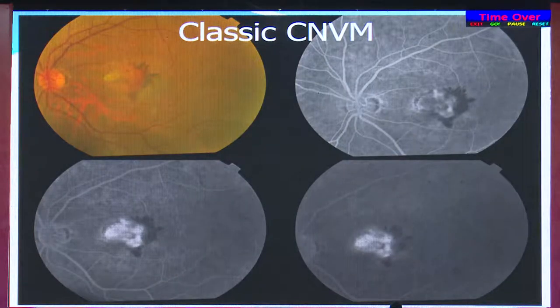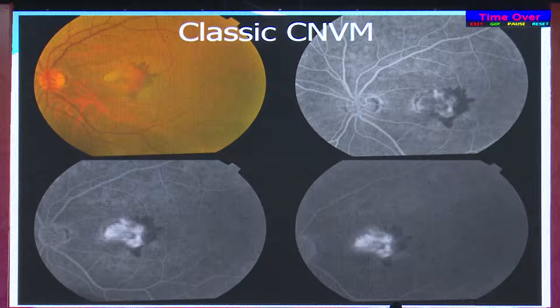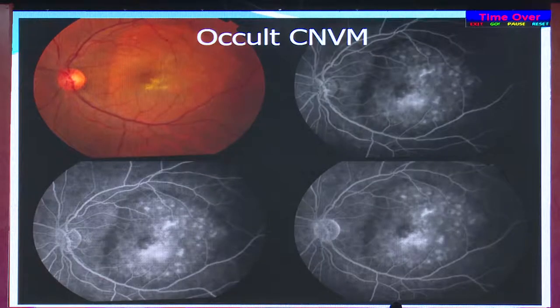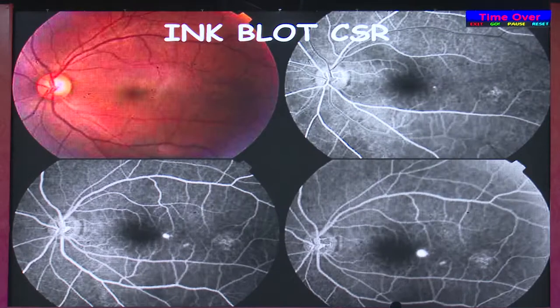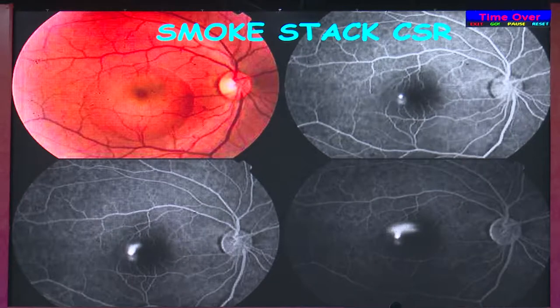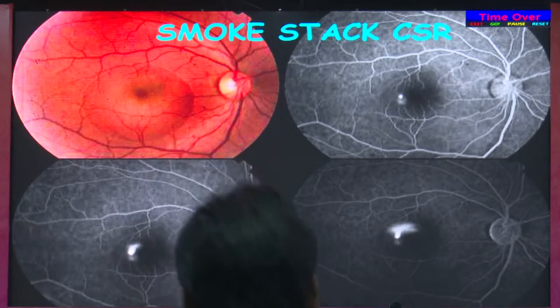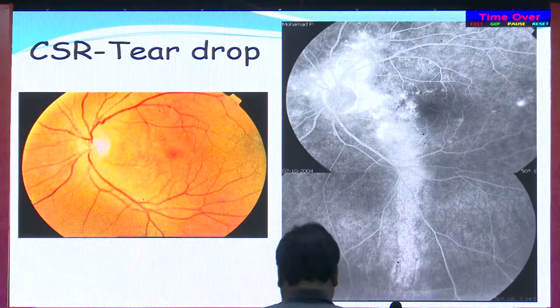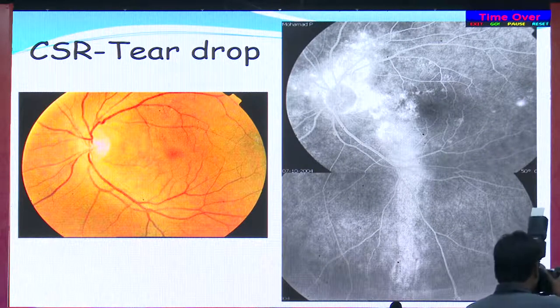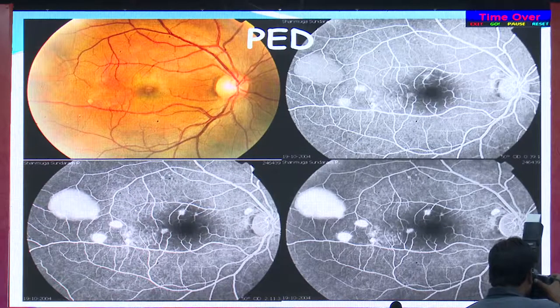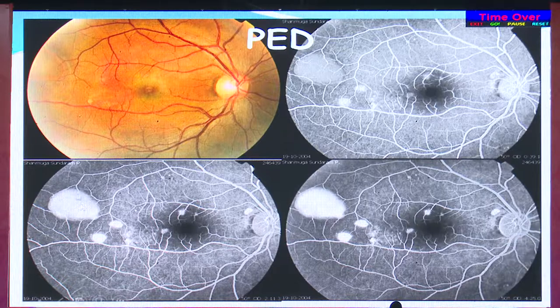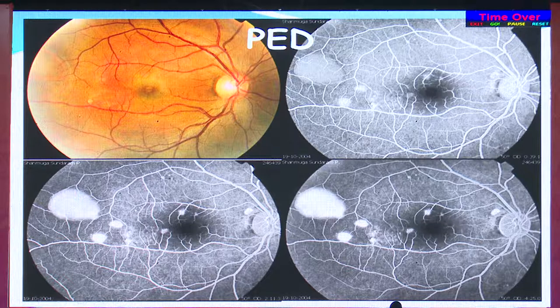In choroidal neovascularization, the classic type shows a cartwheel pattern in the early phases with profuse leakage, while the occult type can present as late leakage or a fibrovascular PED. In CSR, you can get the inkblot type, the smokestack pattern rising from a point leak, a teardrop pattern, or atrophic patches giving transmitted hyperfluorescence. A PED shows well-defined margins, which is how pooling is distinguished from leakage — the margins remain clear in pooling.